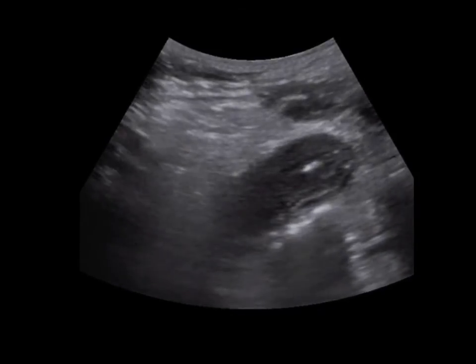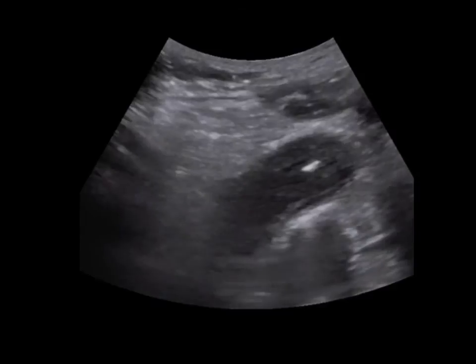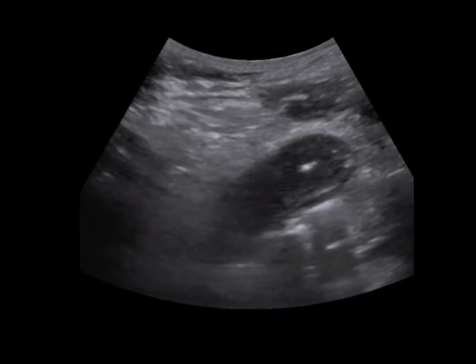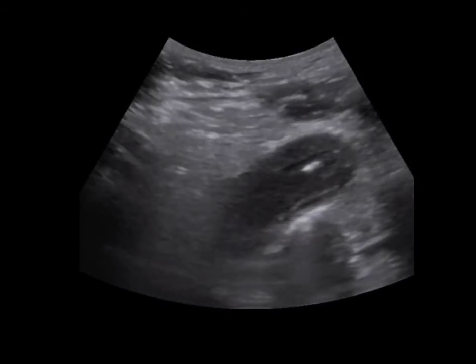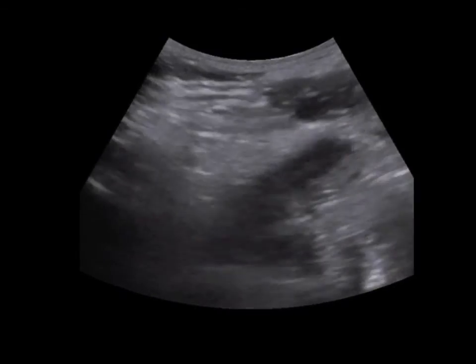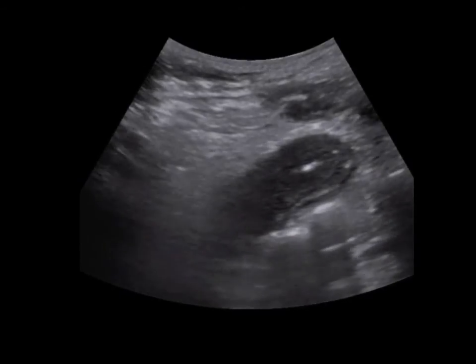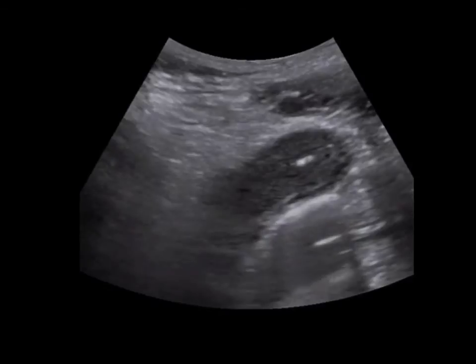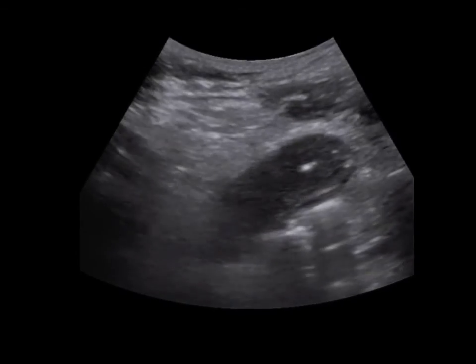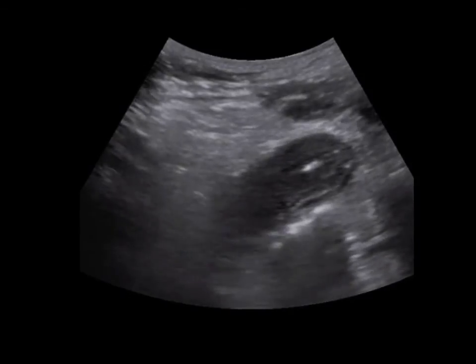Here's another nice example. This is a longitudinal view with a curvilinear probe, looking at a very dilated appendix. I think this one was 12 millimeters in diameter, measured top to bottom. You can see that there's also a fecalith inside this one. And again, lots of hazy fat stranding around the appendix. This is your clue that there's an inflammatory or infectious response in the abdomen.